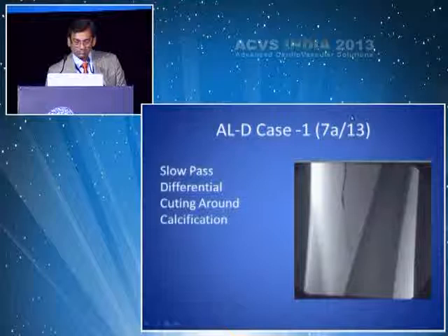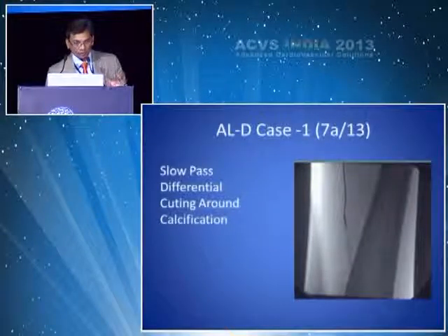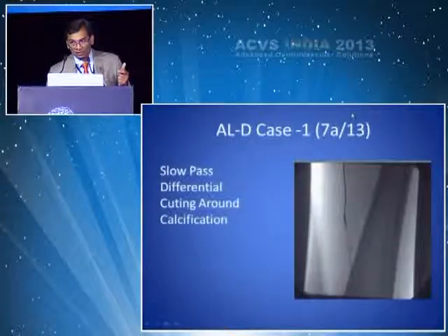This is more demonstration of the slow pass differential cutting technique. Slow pass is also an important aspect. It prevents distal embolization and also obtains optimal atherectomy.